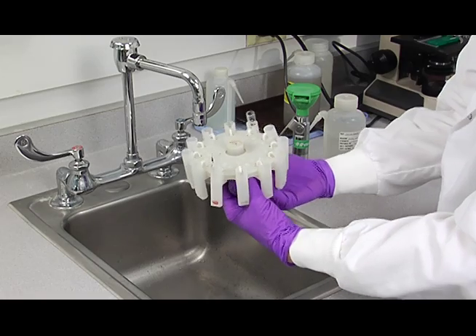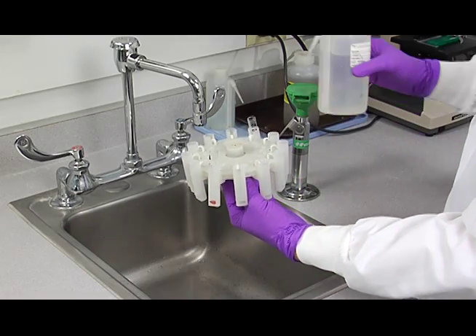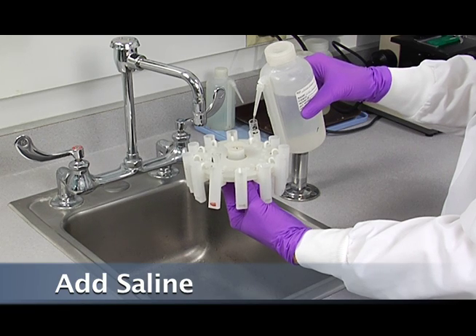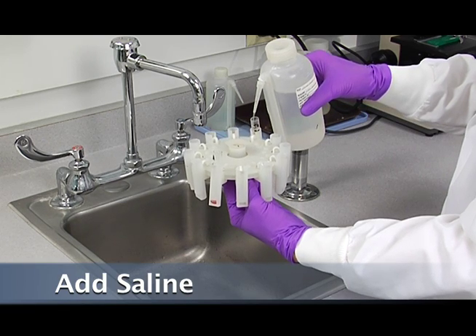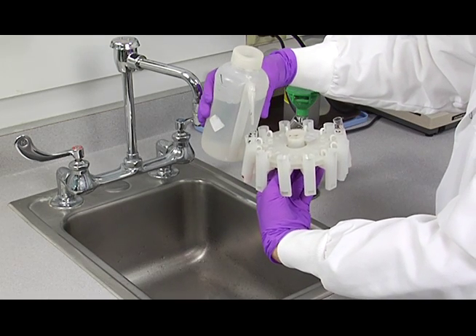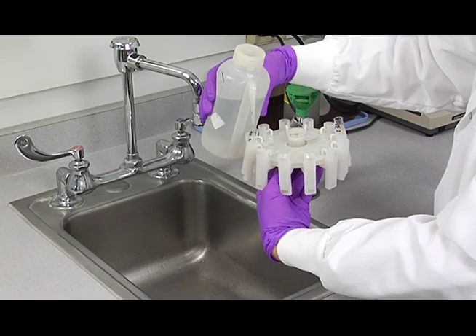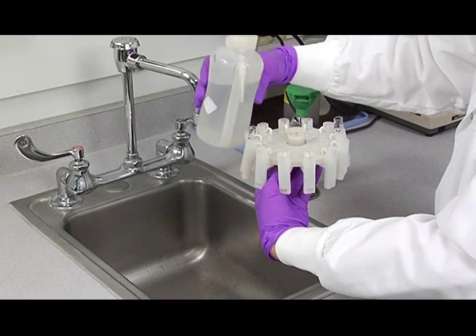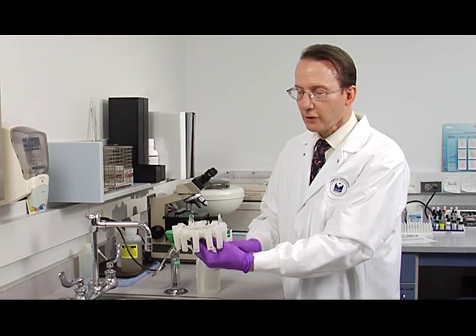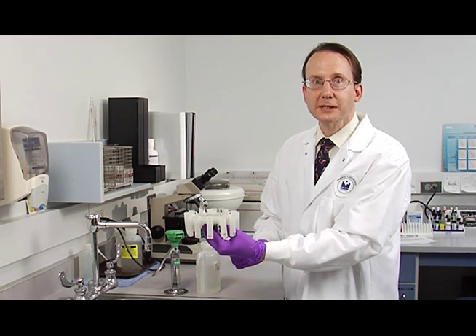Then we're going to add more saline to the tubes after we've drained it out. And you want to be very careful that you don't touch the tip of the saline bottle to your tube because you don't want to contaminate your saline bottle. And then bring it back over to your centrifuge and spin them down for 60 seconds.